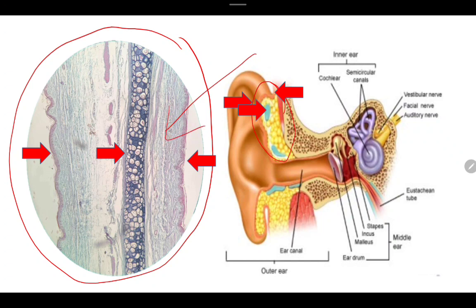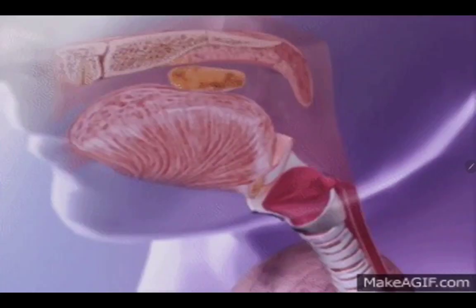There is a perichondrium, and these are the chondrocytes present in the elastic cartilage. Can you appreciate how big and visible the chondrocytes are, as well as that there are no fibers visible? It's because of collagen type 2. Another example is the epiglottis.